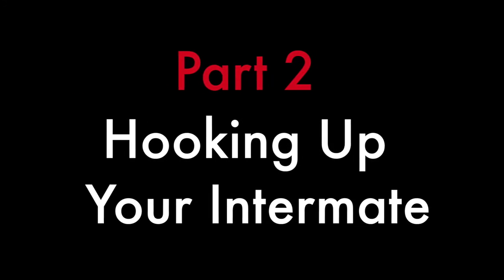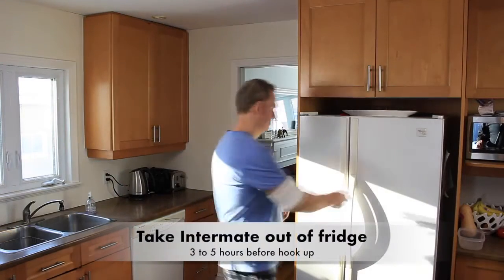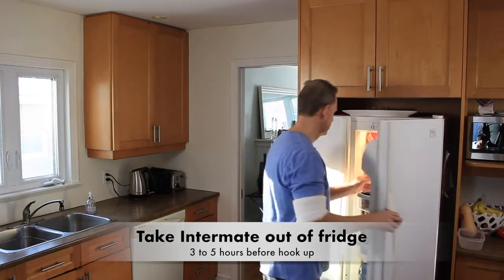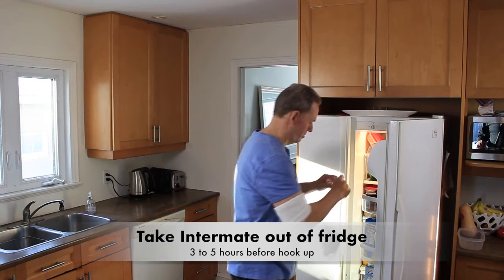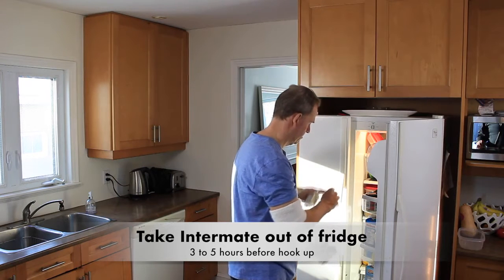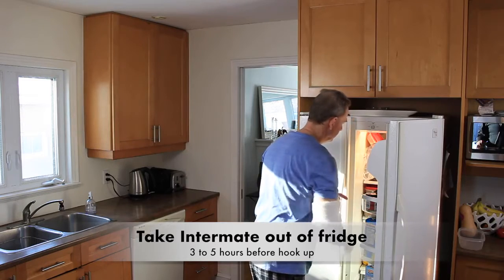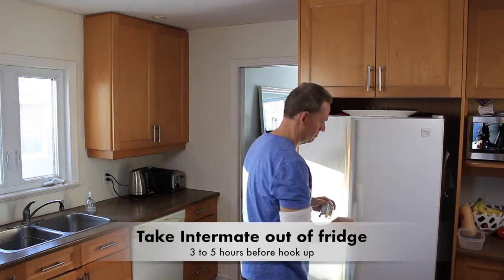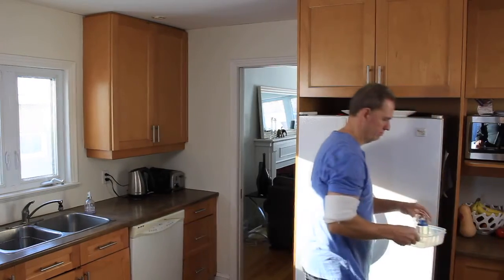Part 2, hooking up your Intermate. You need to take the pump out of the fridge 3 to 5 hours before it's time for the medicine, or however long your nurse told you. You can gather your supplies in a clean plastic container. This can become your work area to keep everything clean. So bring the clean plastic container to the fridge and put your Intermate in it and bring it over to the table.